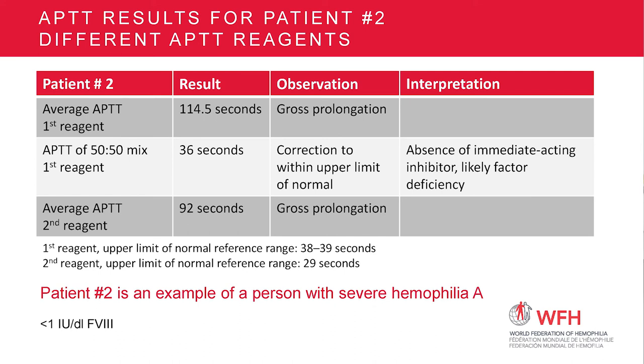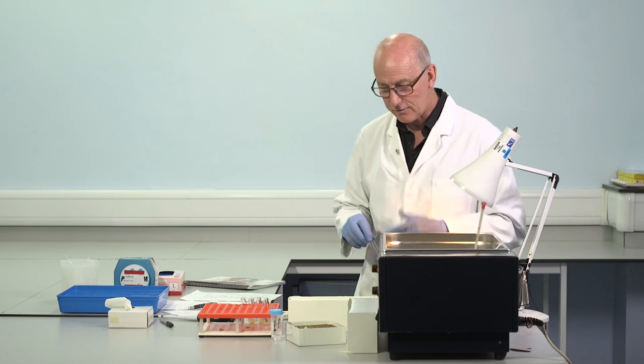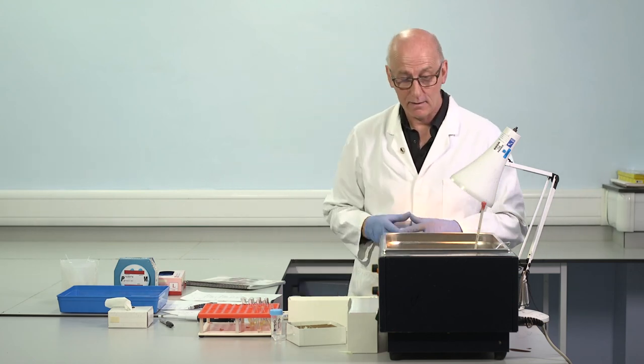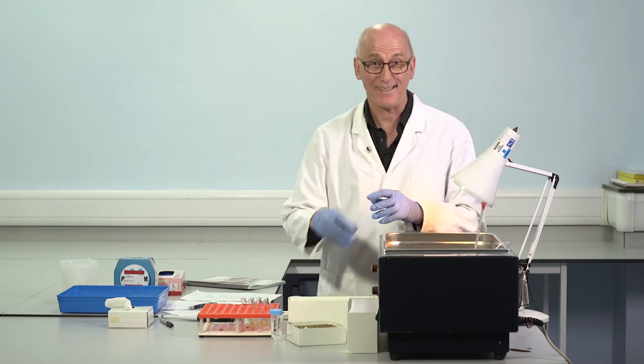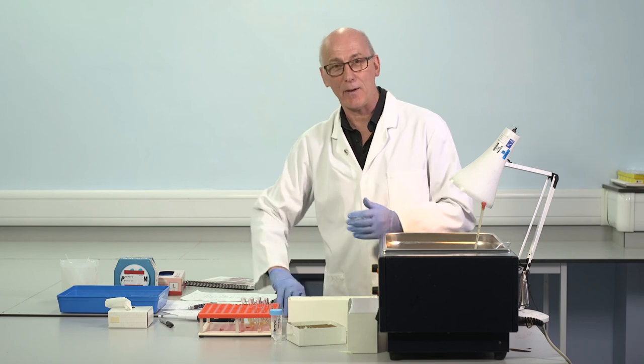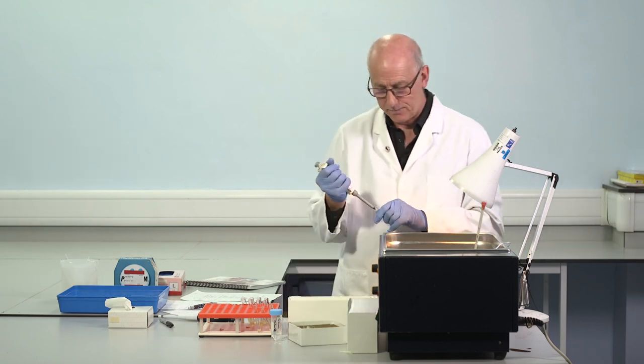Complete absence, less than 1 international unit per deciliter of factor VIII. Essentially no factor VIII. It still clots, I think you know this, but there is a gross prolongation with both reagents. Not the same time, but a gross prolongation. That's typical of severe haemophilia A, typical of severe haemophilia B. We expect to see gross prolongation, irrespective of reagent. Not the same numbers, that depends on the reagent.